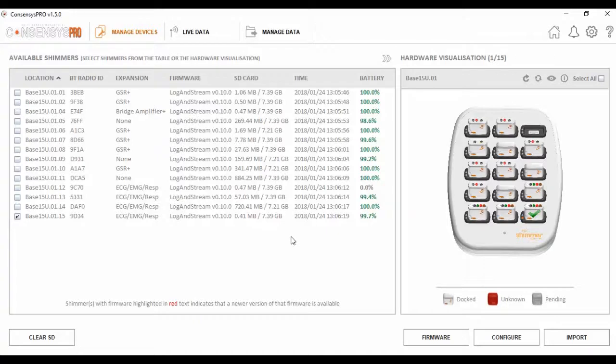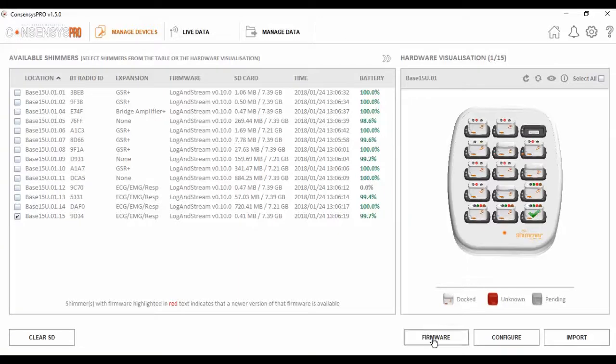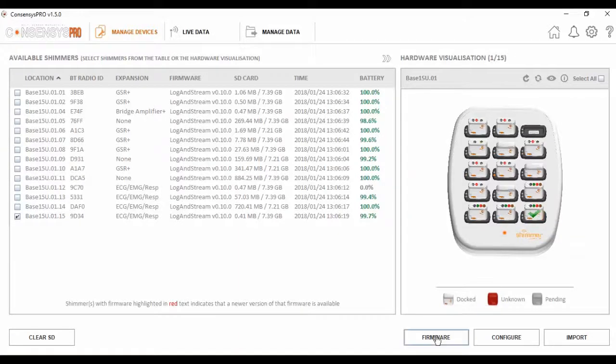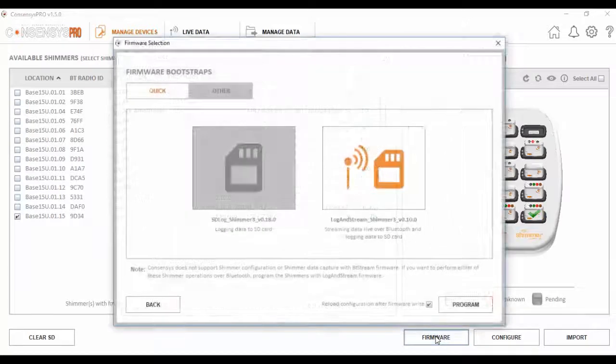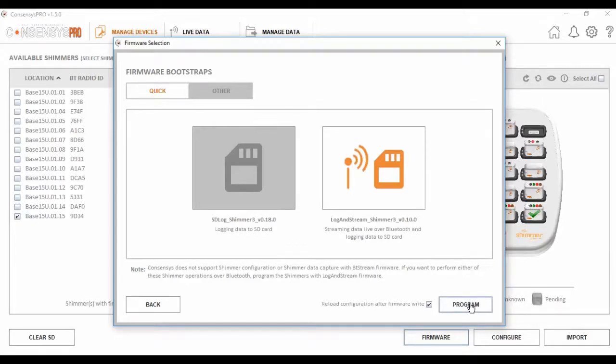Today we are going to collect both logged and live data from the Shimmer3 EMG device. The Shimmer3 EMG has an inbuilt SD card for collecting data, and also has Bluetooth capability for streaming data live. The first step in the data collection process is to ensure the firmware is set correctly. I select the unit I want to collect data from, and then click the firmware. The firmware I want to use today is LogAndStream, so I simply select this, and then write to the unit.